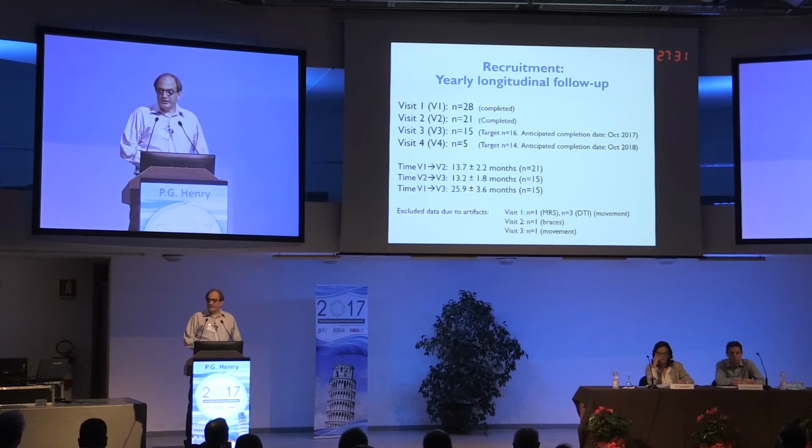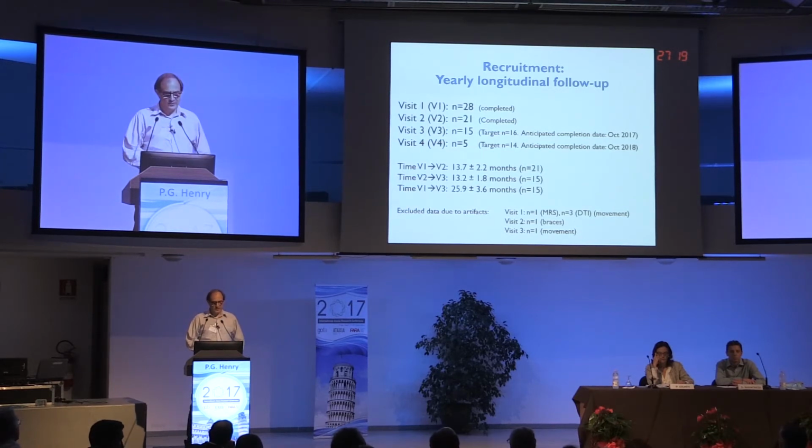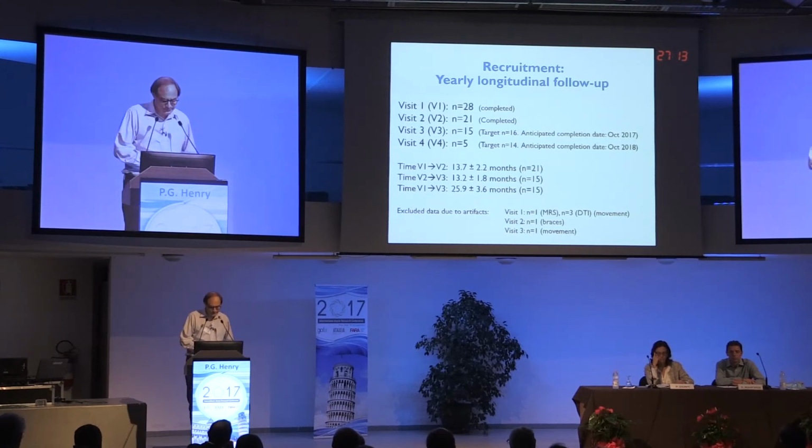We have a few data sets excluded, most often due to movement, creating artifact in the images. But we also had one subject who had braces, and that caused artifact in the images. So from that point on, we added that as an exclusion criteria, braces.